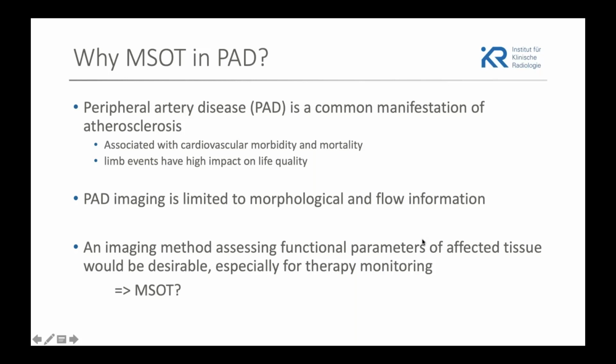You just go with all your imaging methods, either MRI, CT, ultrasound. You look at the stenosis itself, see how much the stenosis is occluding the vessel. You see how much the flow is increased or decreased in the macrovascular vessels, but no one can look at the affected tissue by this disease. No one has an idea what is going on in the affected tissue, which is causing the problems to the patient because the muscle or the subcutaneous fat or the skin is not perfused anymore. So again, we thought maybe this would be a good application for MSOT in a more common disease than the vascular malformations.